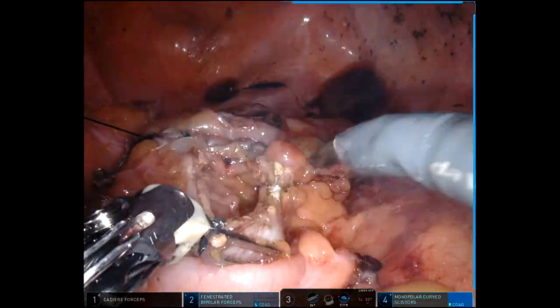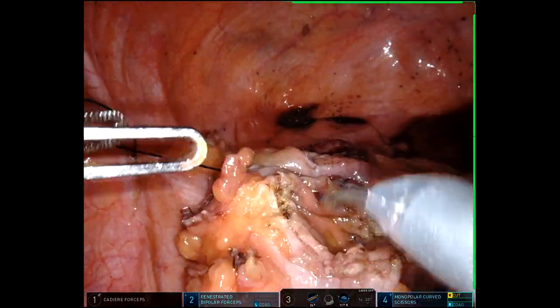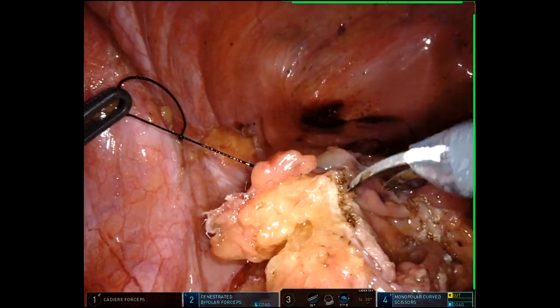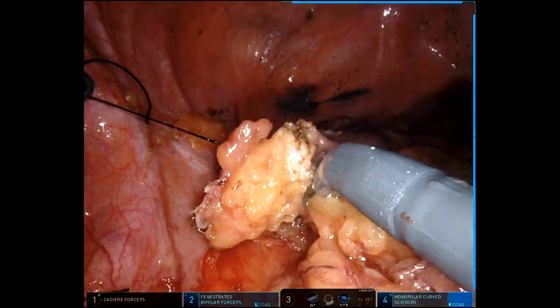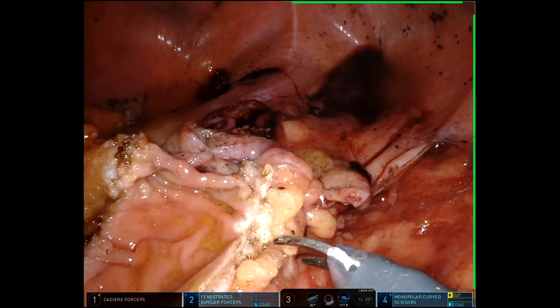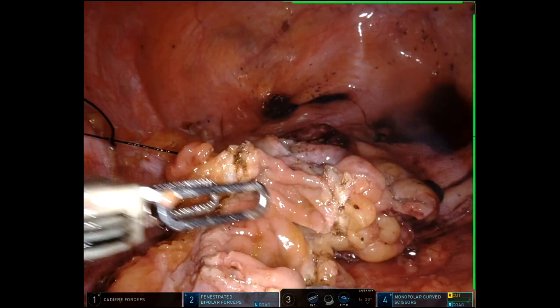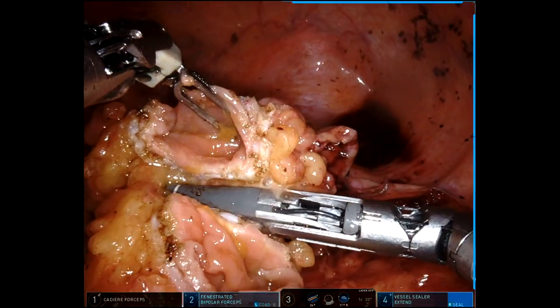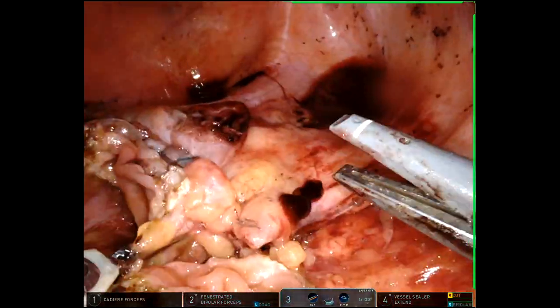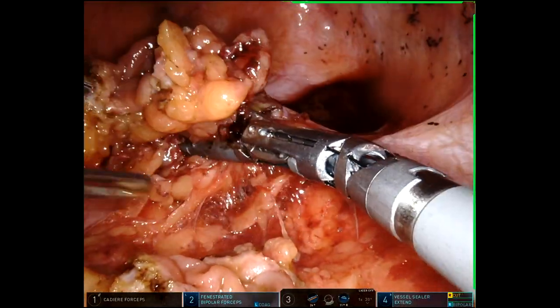I will not accept that, despite the fact that this would have been a two-layer anastomosis — I'm not leaving that. So I'm now going to convert this to an end-to-end anastomosis, which is what I did the first time I ran into this trouble. I'm very happy with both two-layer and single-layer anastomosis in this region. I don't think one has advantages over the other. The single-layer is faster, and anecdotally I think two-layers makes me feel more secure as it imbricates more tissue.